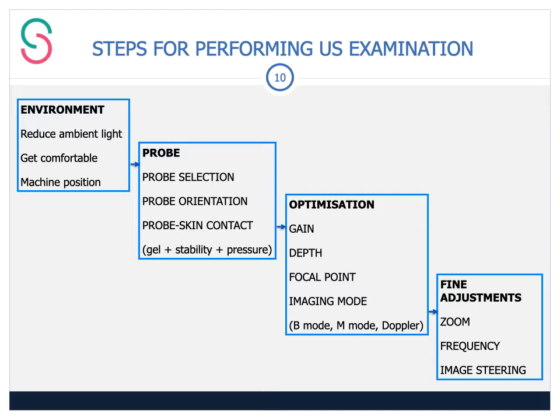And of course you need to choose your imaging mode. So as we said before, there are 3 general imaging modes called B mode, M mode, and Doppler. Typically examinations start with B mode, 2-dimensional brightness mode, and then as you progress through the examination you might want to use M mode or Doppler to get more information.